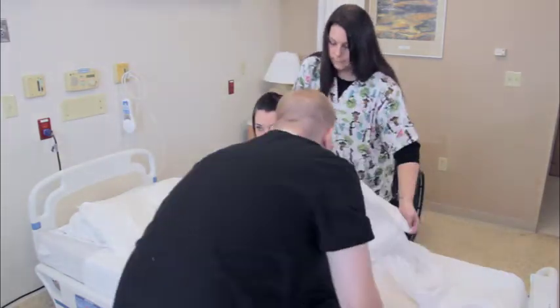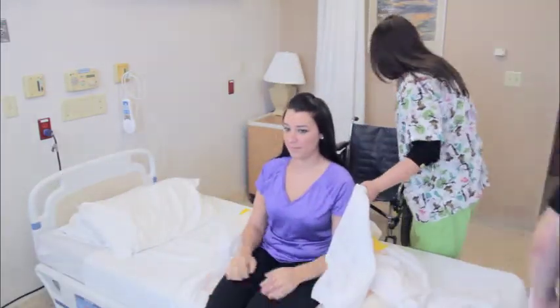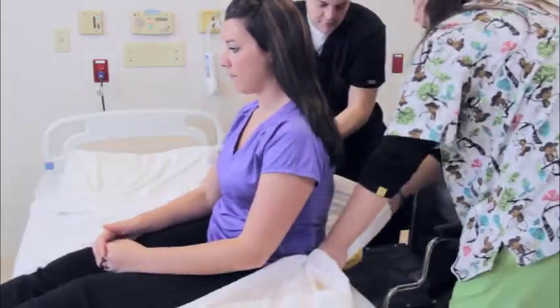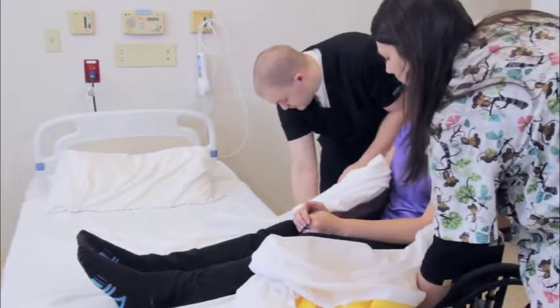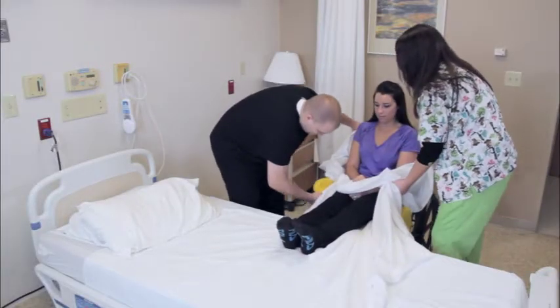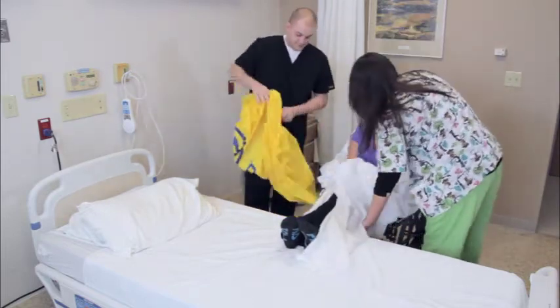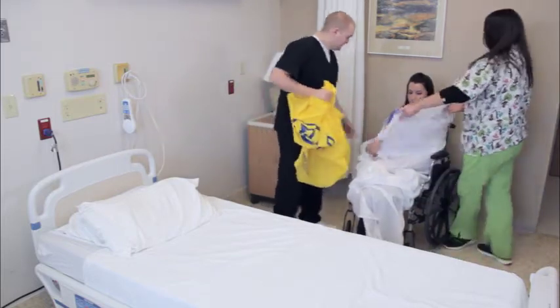With the wheelchair next to the bed and the wheels locked for safety, pick the patient's legs up and pivot her in the direction opposite the move. With one person on each side of the patient, gently slide the patient into the chair. Remove the Slip from underneath the patient, unlock the chair, and back it slowly away from the bed. Simply reverse the process to transfer the patient back to the bed from the wheelchair.